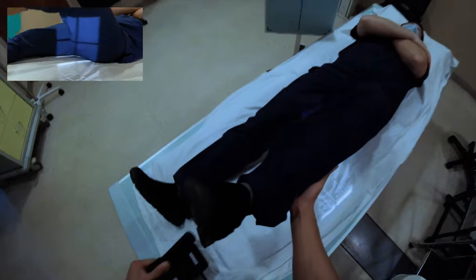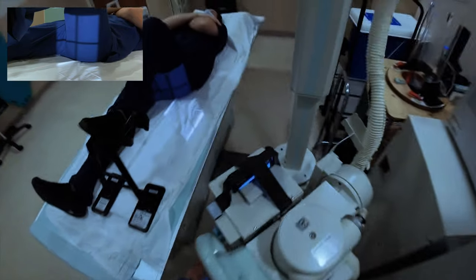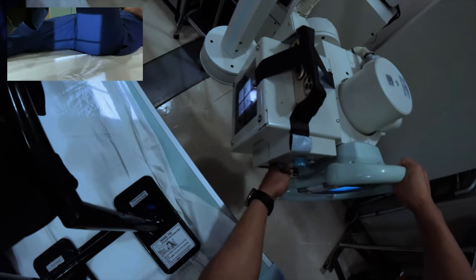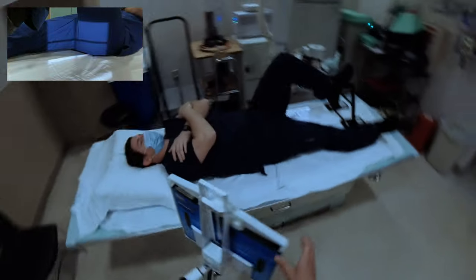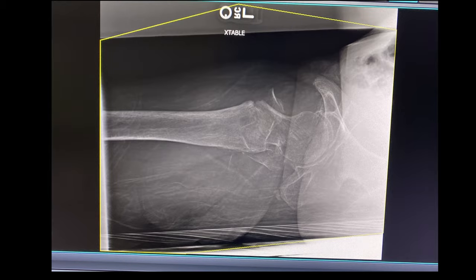All right, so with your left leg, we're going to bend your left knee towards your chest. So bring this up, and then we're going to put your foot on this holder here. Bring it up more if you can. Is that all right right there? Yeah. All right, hold that still there for me. Doing all right? All right, hold still. All right, we're all done.